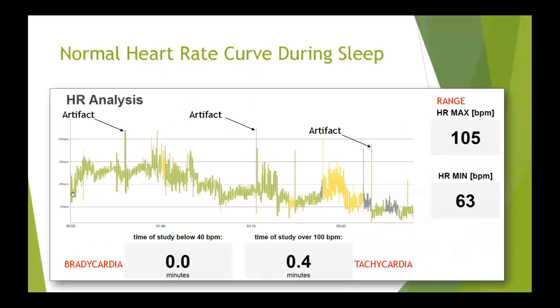Here's a heart rate graph that's normal. There's a little bit of artifact — three or four spikes sticking out of nowhere — and in this case it really doesn't have an impact on our interpretation. There's a little bit of tachycardia, but that's very likely due to artifact. This patient's heart rate range and variability looks normal overall.